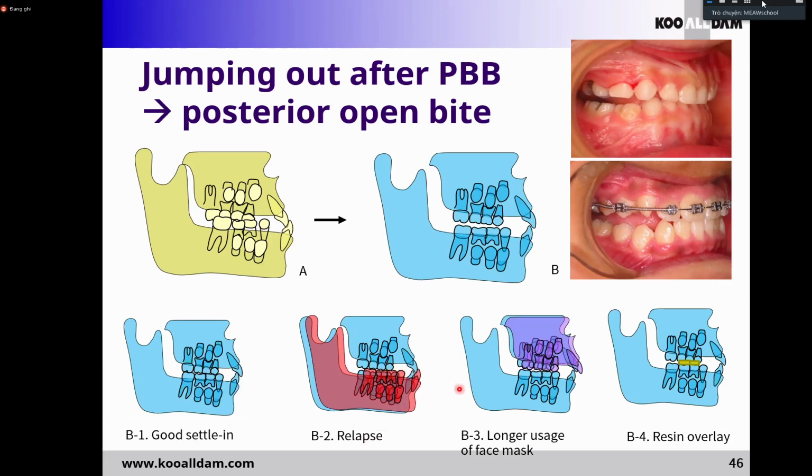So many orthodontists use the face mask longer. However, in clinic, it is not easy to achieve this kind of tooth or maxillary movement. So this time we may insert resin overlay in this area. At that time, lower second primary molar retention is good for treatment timing.